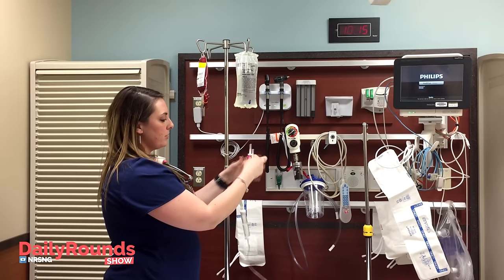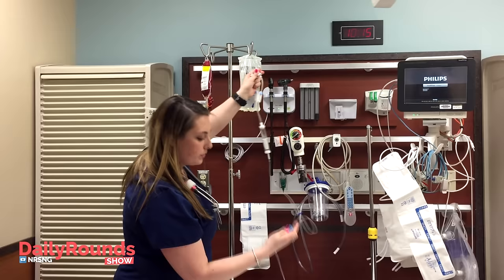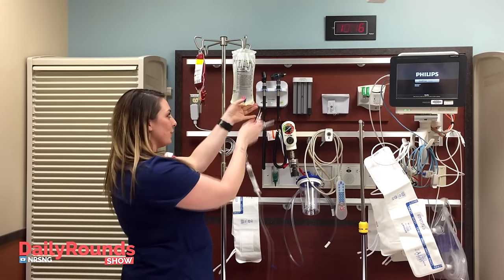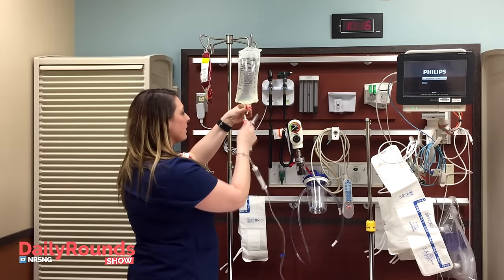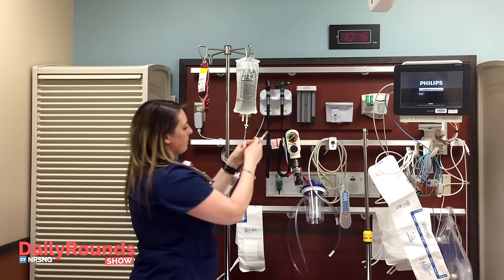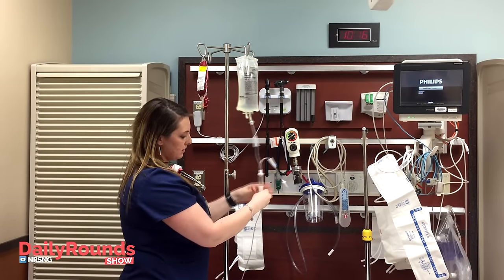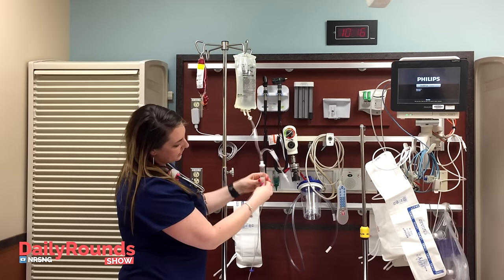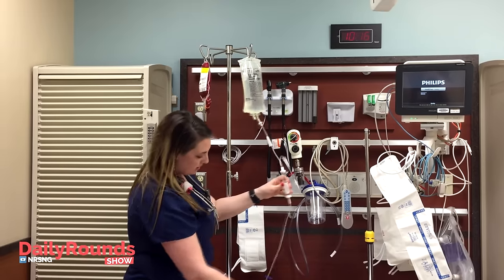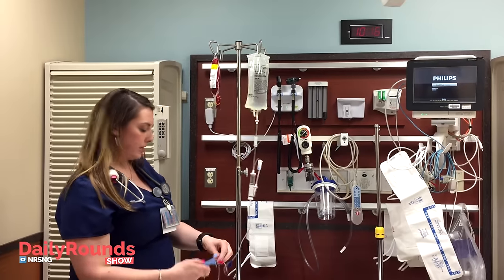Before you start, clamp and make sure that every single clamp you have is closed — all the rollers. The first thing you want to spike is your normal saline. Then you will squeeze it so that it comes up to at least halfway, and then you clear it all the way down your line.